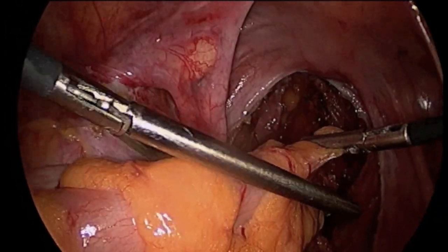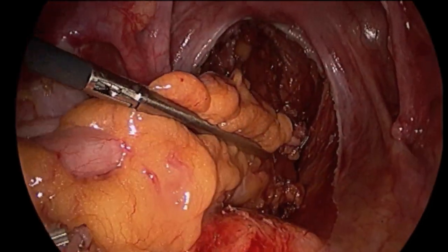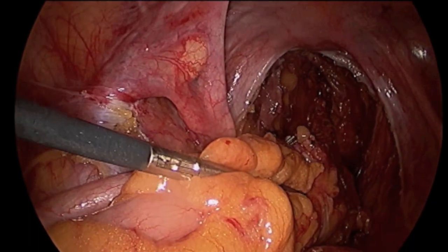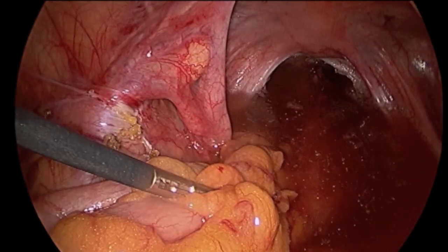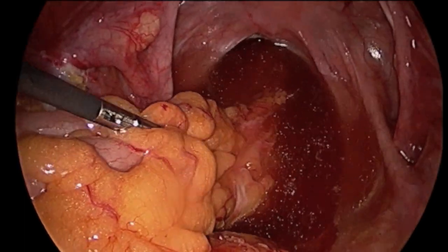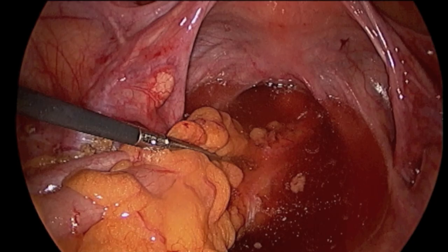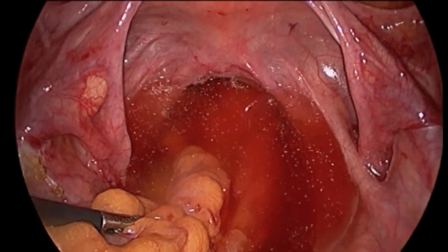A clamp is then placed across the lower colon. The pelvis is filled with saline and the proctoscope is inserted into the rectum. The rectum is filled with air, and the absence of bubbles in the saline confirms that the stapler has created an airtight seal at the new bowel connection.